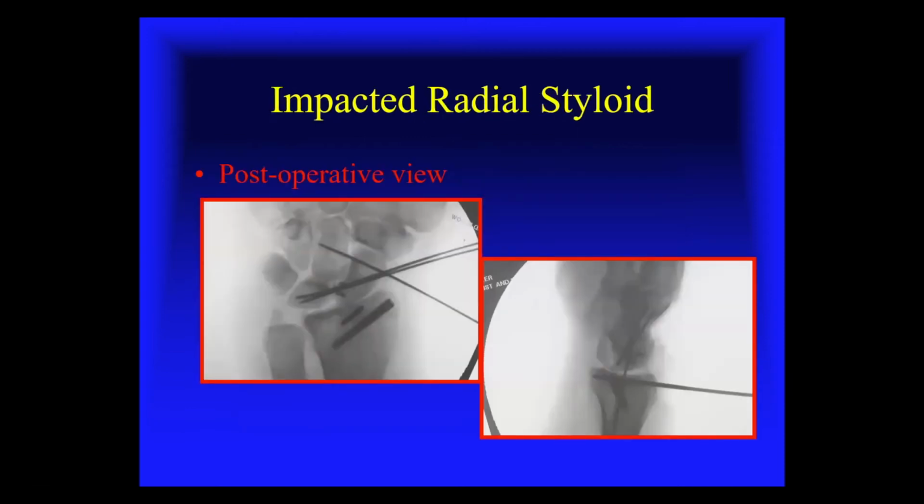So I think we got that articular surface absolutely perfect. This was an older case. We still use pins rather than a screw. There was an interosseous ligament injury with that.